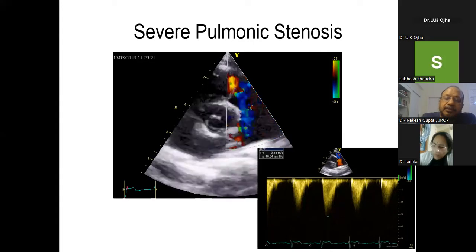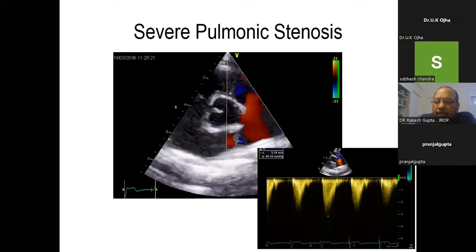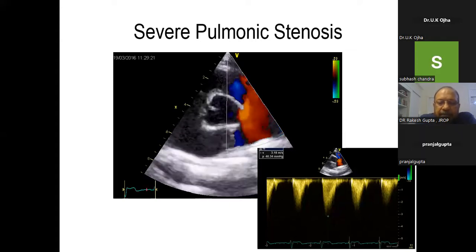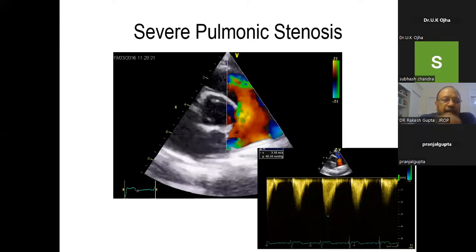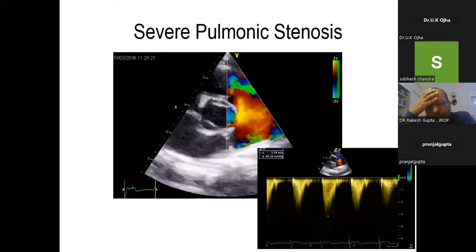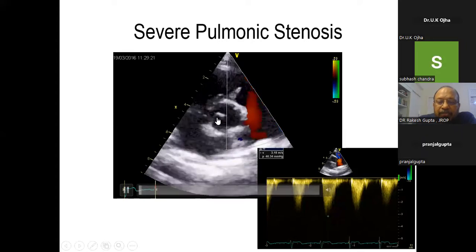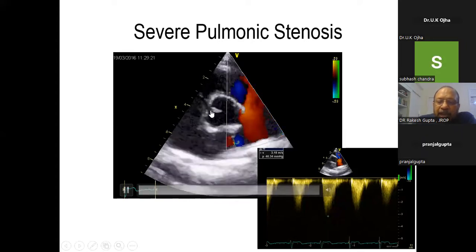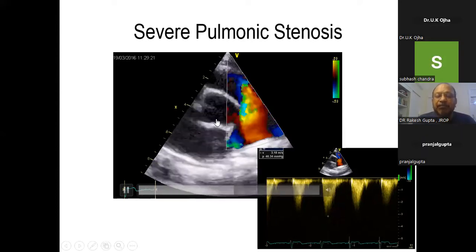Sir, any comment on the bicuspid aortic valve? Sometimes it is difficult to comment on the aortic valve. So what is the best view? The short axis view at the aorta. If you happen to look at the opening of these valves, just zoom on these valves and you happen to see all 3 valves. And when the aortic valve opens, it is an inverted triangle.